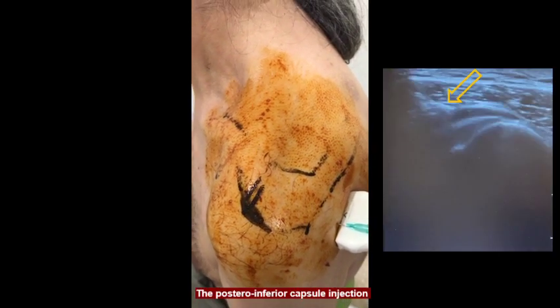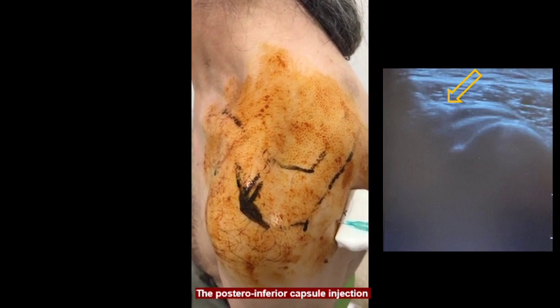Then, 5 ml is injected into the outer surface of the posterior-inferior capsule.